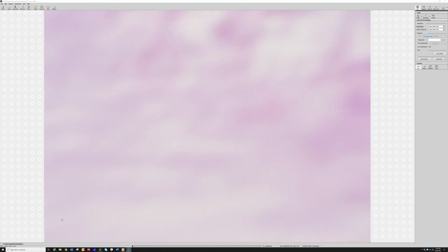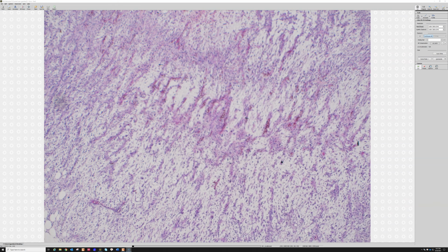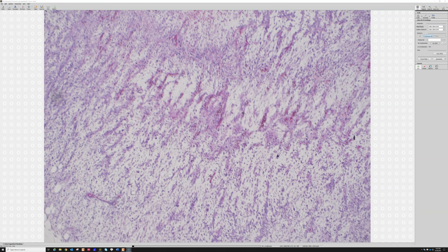Now let's go down and look at them cytologically. Oh yeah, before we do that though, notice what else is here. Look at these parallel lines running through here. These are all blood vessels. These long vessels kind of run along, and as they run, they gently curve and undulate. See how they're kind of curving back and forth as they go? So we call these curvy linear vessels.